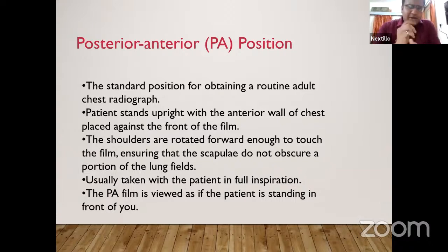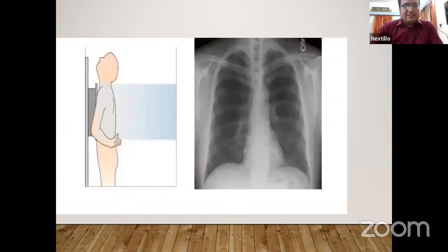One more thing: these kinds of X-rays are always taken in full inspiration. What is the concept behind full inspiration? Just think about it. In a PA X-ray, we are looking at the lung fields. What if the patient is not in full inspiration? We will not be able to see some part of the lung due to poor inspiration, so a pathology lying in that part of the lung could be obscured. That's why we take the patient in full inspiration. Now let's move to the next.